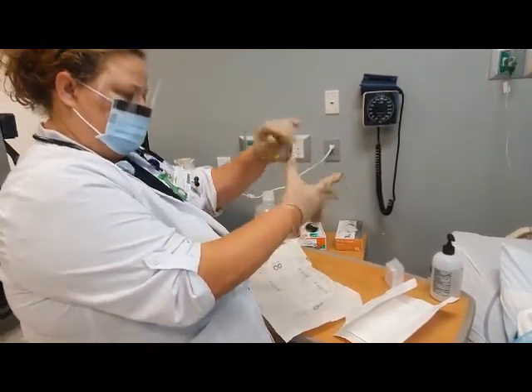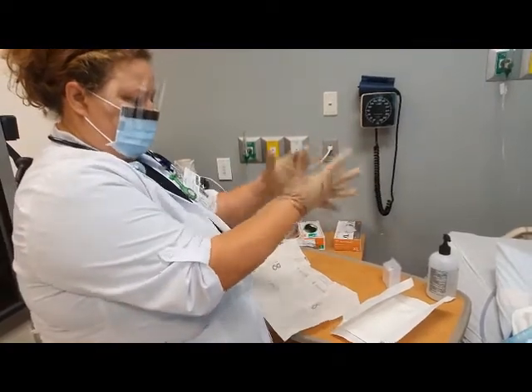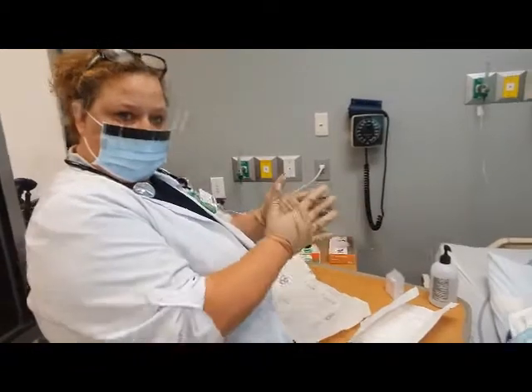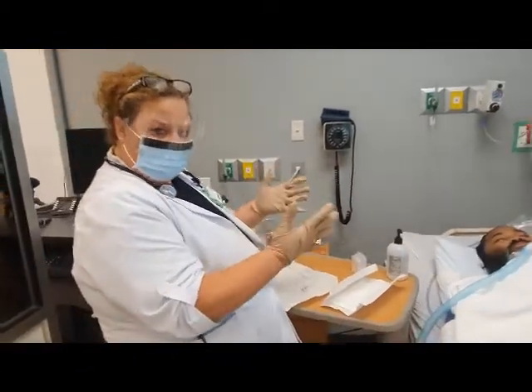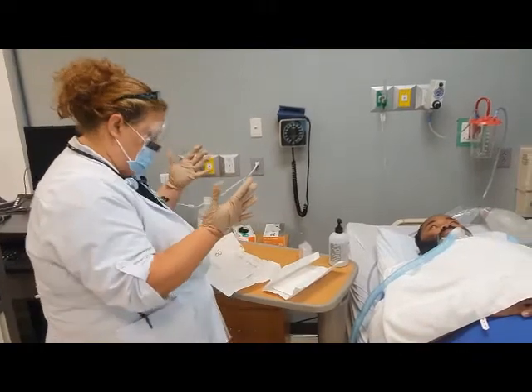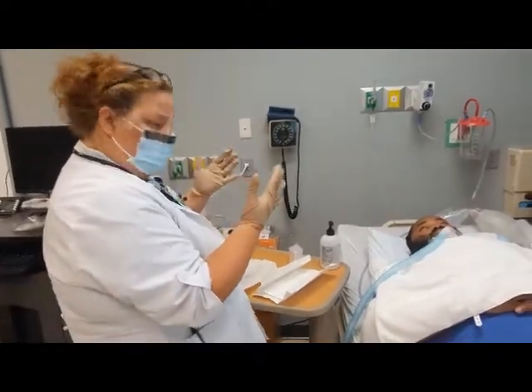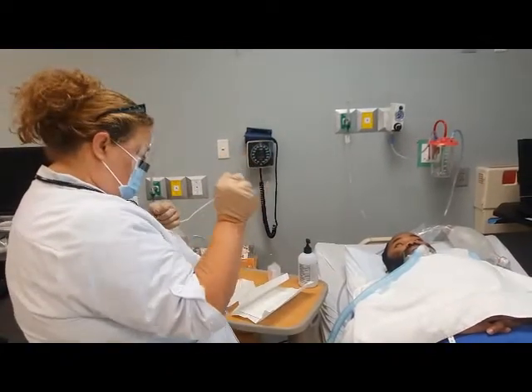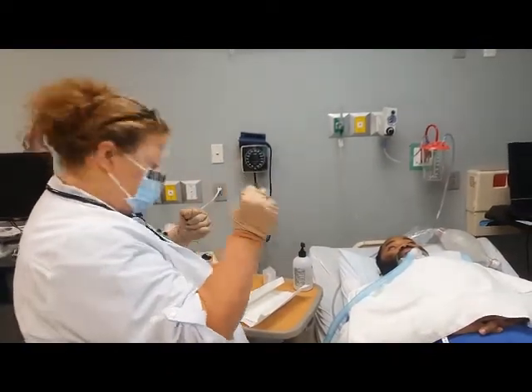Now, once you have the gloves on, you can fix them the way you need them. Now, sterile gloves, you need to keep your hands right up here, okay? Do not drop them below your waist, because if you do, you're probably going to contaminate. At this time, with your sterile dominant hand, pick up your suction catheter, maintaining it in a loop as best you can. Okay, so this is my dominant hand.